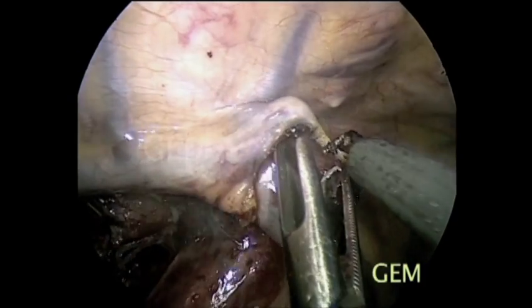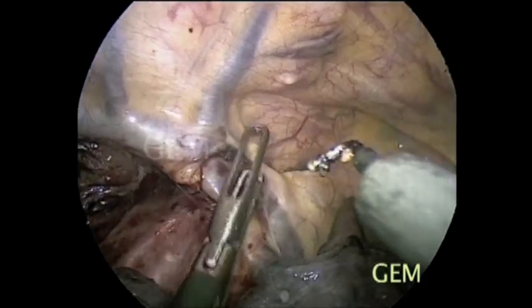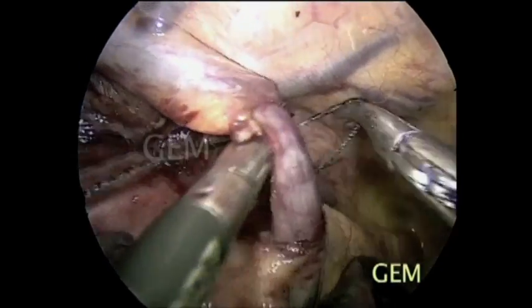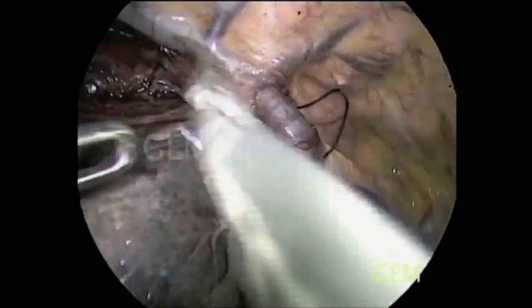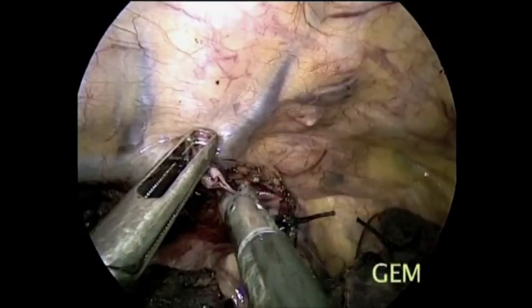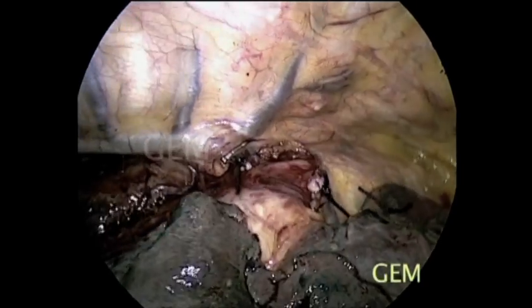If it is a squamous carcinoma and reaching is not possible, we have to go to the neck, or consider colon interposition. You can see the azygos vein; we put a tape for control. One can comfortably divide it with the endocutter, but in developing countries we try to use ligature, which is much safer.